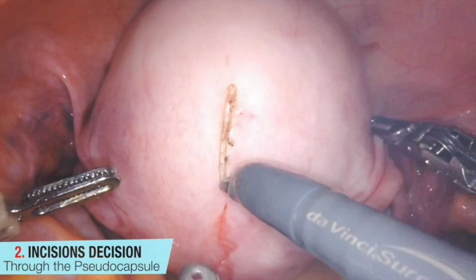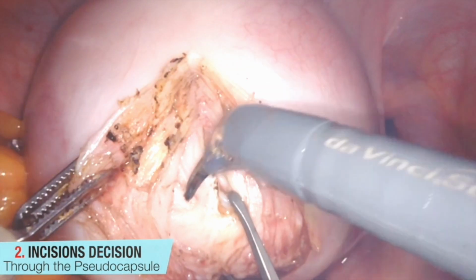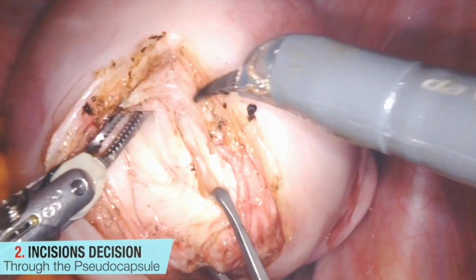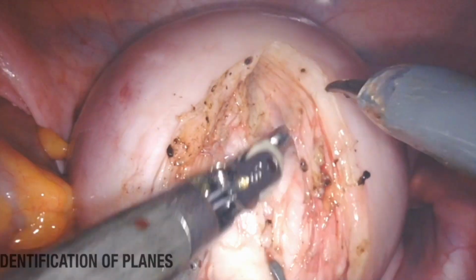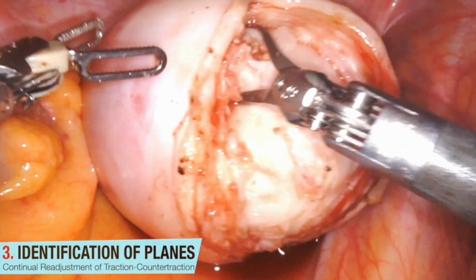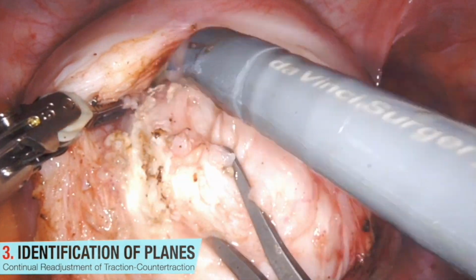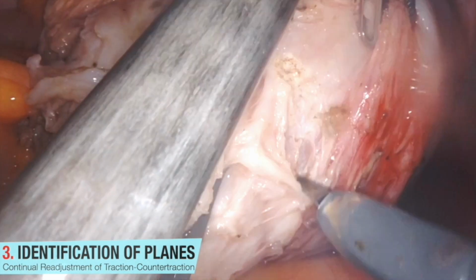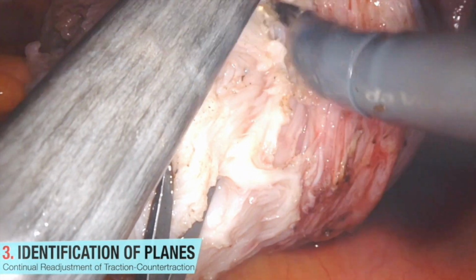Next, an incision is made around the myoma and carried through the tissue of the fibroid. The incision was extended to facilitate extraction of the myoma and identification of the best surgical plane. Circumferential sharp and blunt dissection, as well as electrocautery and traction and countertraction with a single tooth tenaculum were all used to achieve an avascular plane.